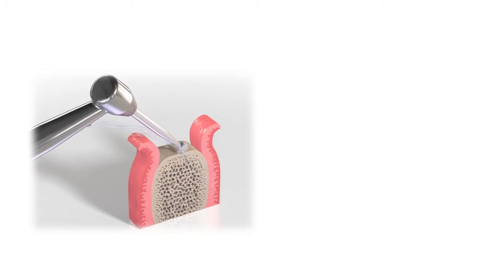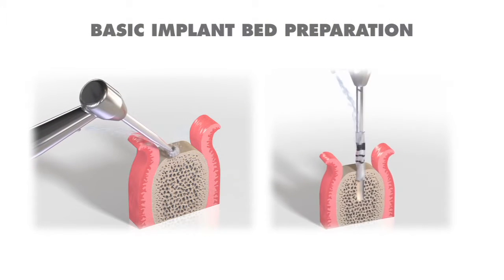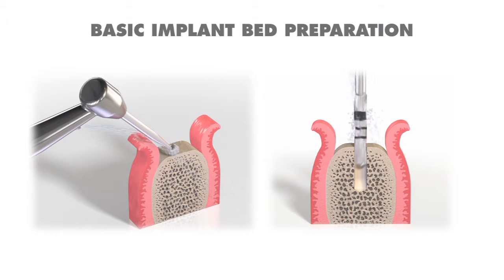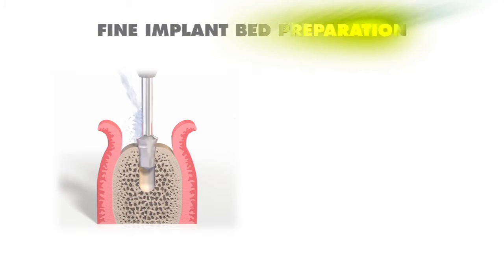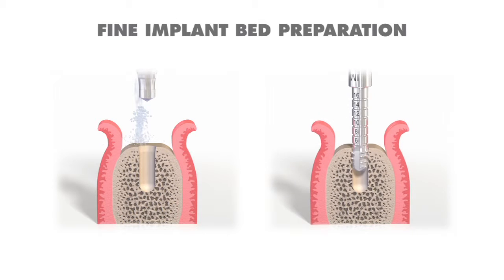Preparation includes 2 main steps. First is basic implant bed preparation. This step involves ridge preparation and twist drilling. The second step is fine implant bed preparation. This includes profile drilling and tapping.